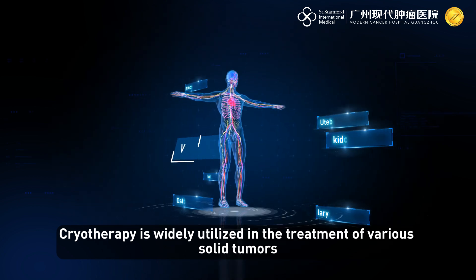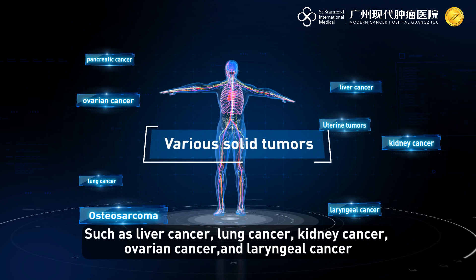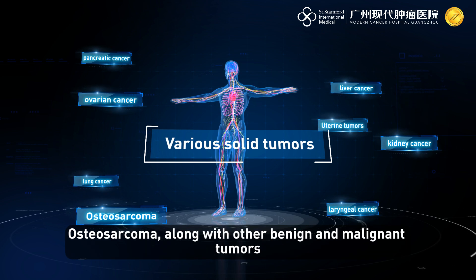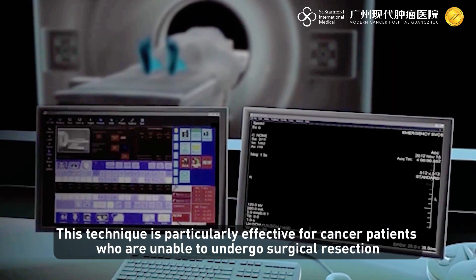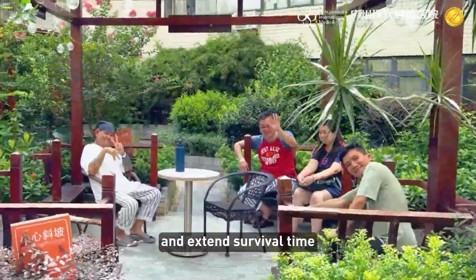Cryotherapy is widely utilized in the treatment of various solid tumors such as liver cancer, lung cancer, kidney cancer, ovarian cancer, laryngeal cancer, uterine tumors, pancreatic cancer, breast cancer, and osteosarcoma, along with other benign and malignant tumors. This technique is particularly effective for patients unable to undergo surgical resection, as well as those with advanced-stage cancer, as it can effectively alleviate pain and extend survival time.